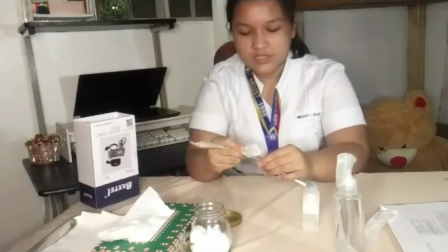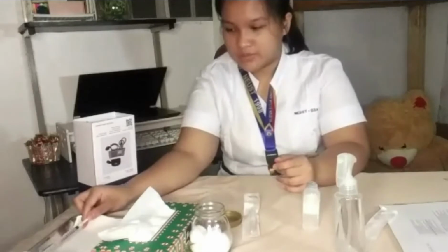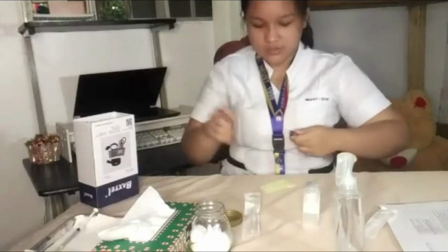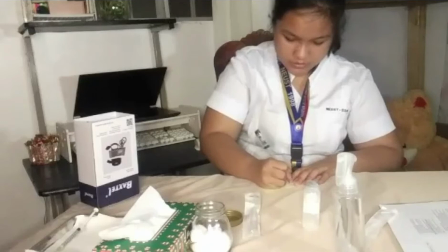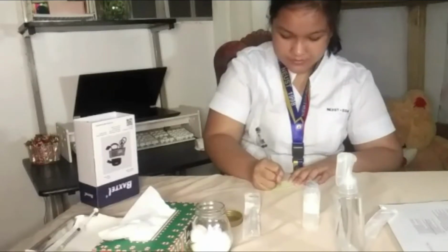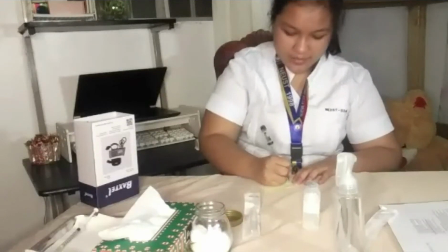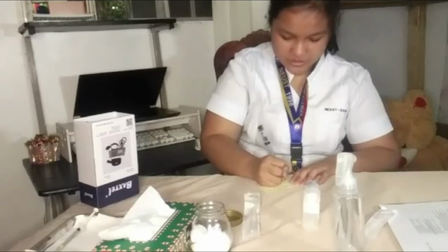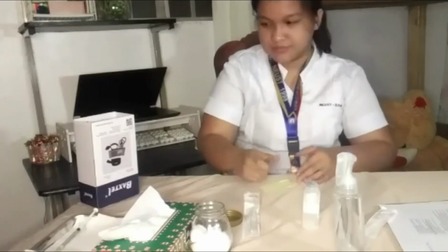I'm going to put it on tightly so it won't be loose. Put it on my tray. And then I won't forget to note on the medication card the medicine that I'm going to use, the dosage, and making sure that it is the right patient that will receive the medication.